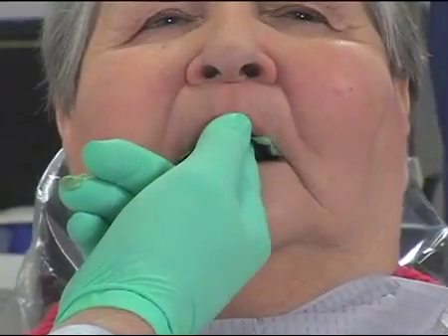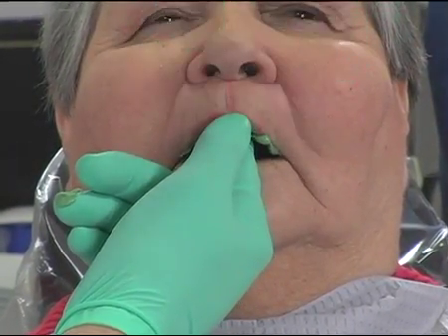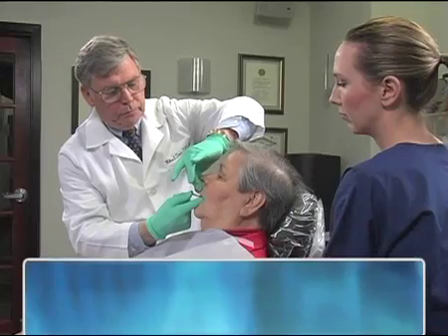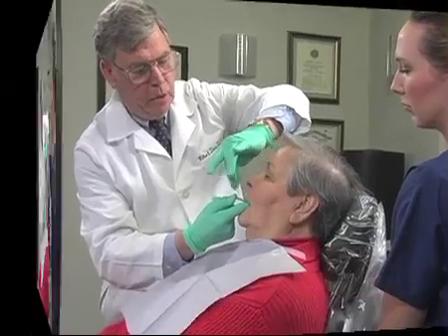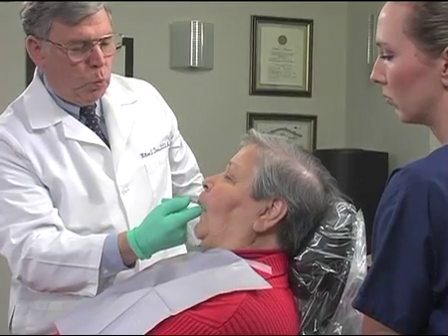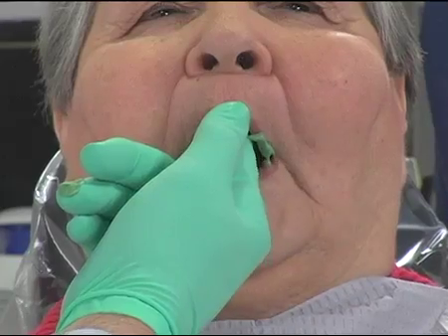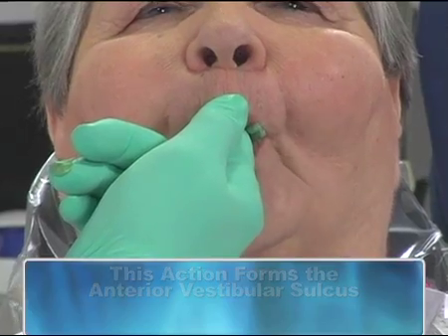Border movements include 1. Grasping the philtrum close to the lip line and pulling downward. This identifies the anterior frenum. 2. Pooching the lips outward with a sucking action. This will form the anterior vestibular sulcus.